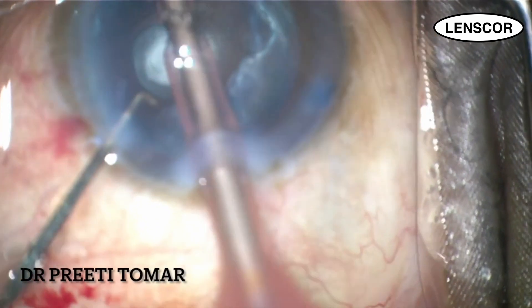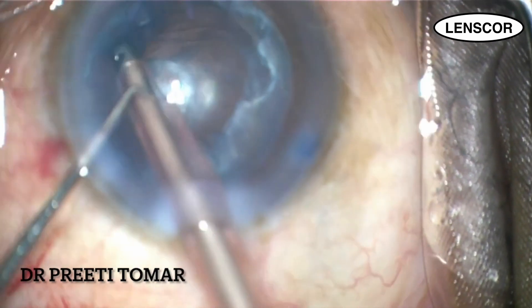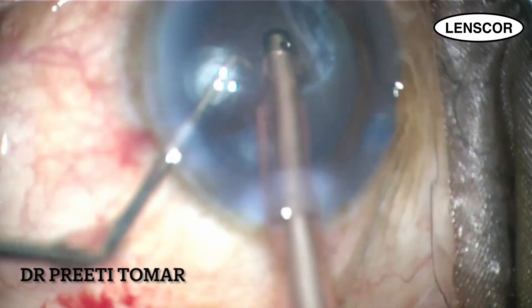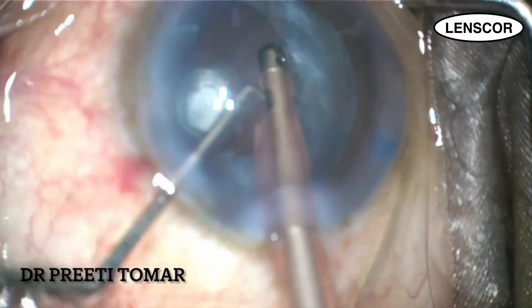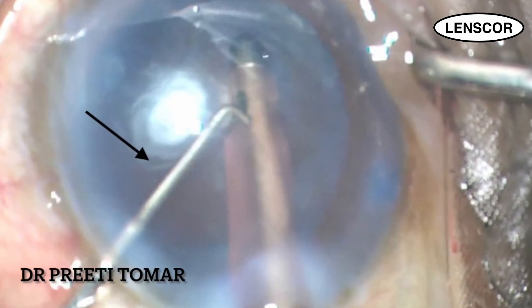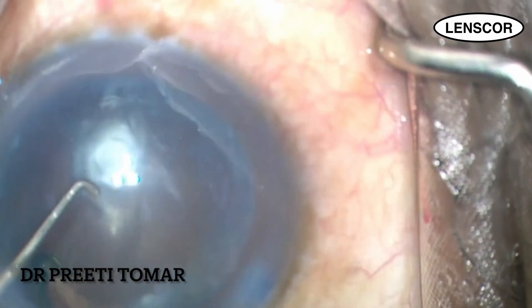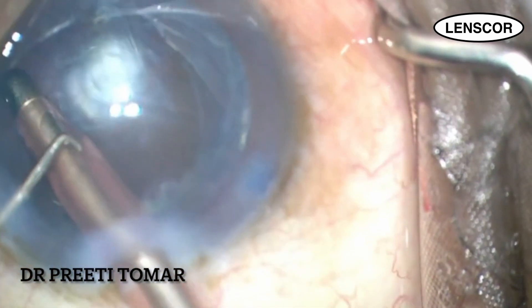We can also use intraoperative optical coherence tomography at this step to assess the status of the posterior capsule. Halfway along the aspiration, I notice a hint of an underlying capsular tear. At this stage it is difficult to assess the entire extent, but it's a warning sign of the capsule giving away.